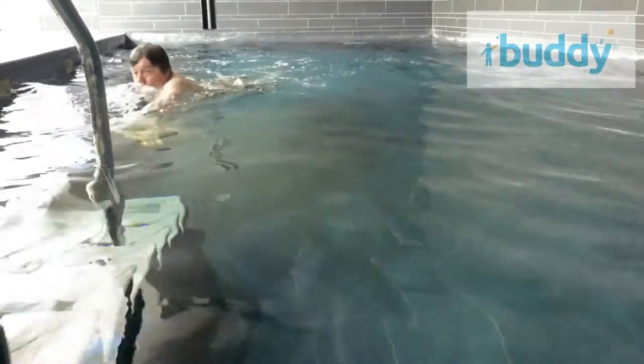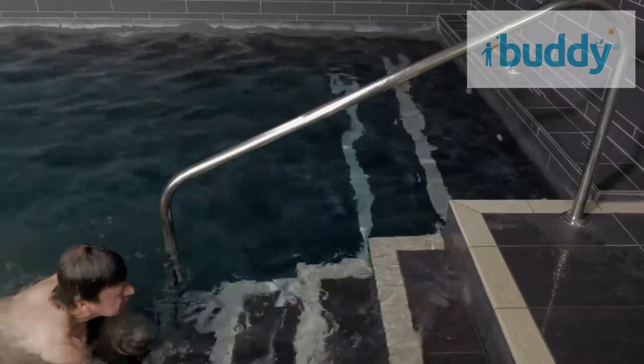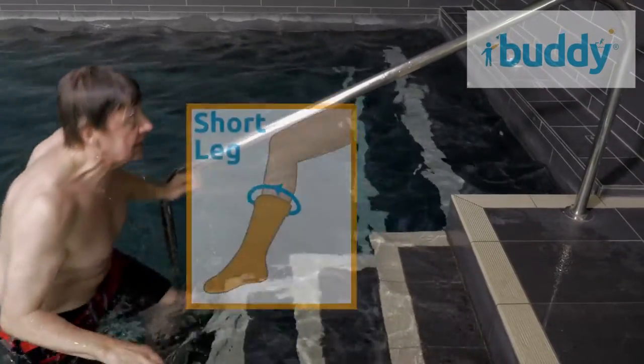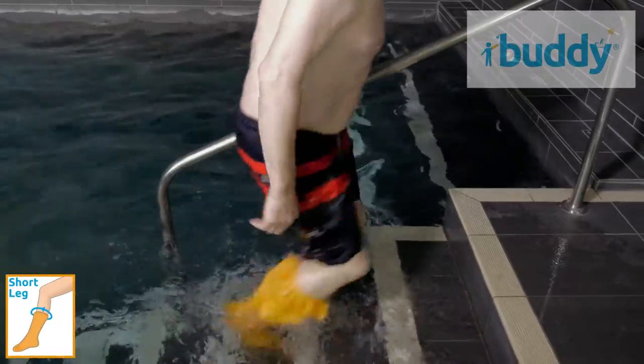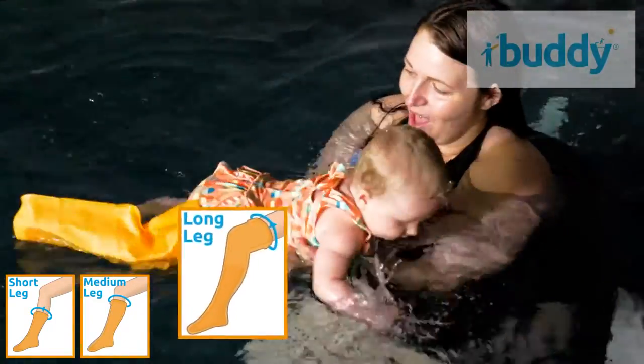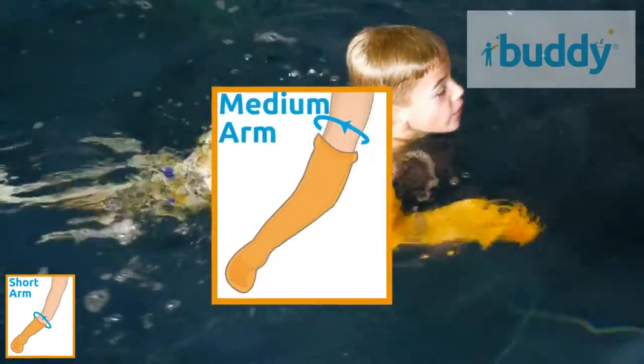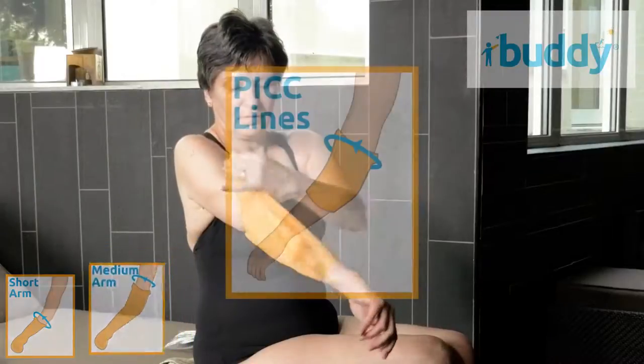Buddy covers keep your dressing or cast dry and protect you from harmful bacteria that could lead to infection. Buddy covers are available in aperture sizes and lengths to suit everyone, including babies and children, and to cover casts and bandages wherever they are on your limb.